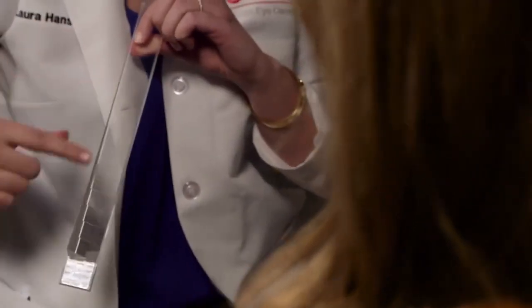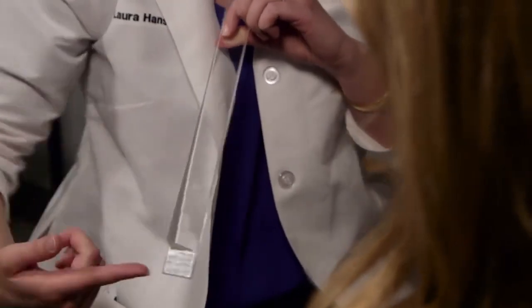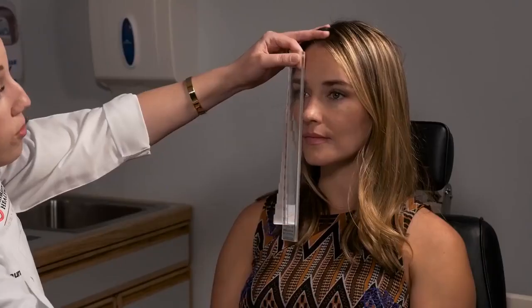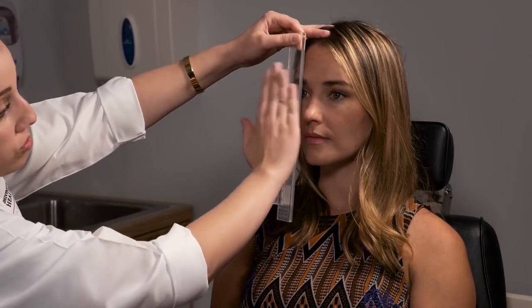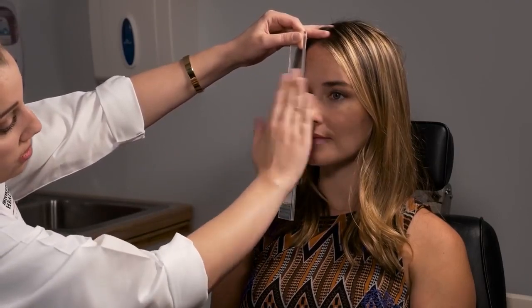You can tell because the base is oriented out to the side. In a vertical prism bar, the base will be oriented on the bottom portion of each prism. And so if you're looking to measure a deviation, you point the apex in the direction of the deviation, you hold it over one eye, and if you want to measure a phoria, you do the cross-cover test, adding increasing amounts of prism until you've neutralized the deviation. For her, I'm actually inducing one because she's very well aligned.